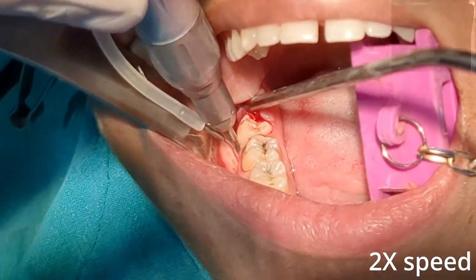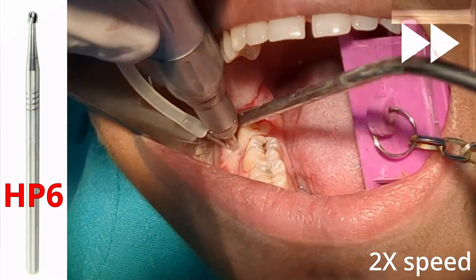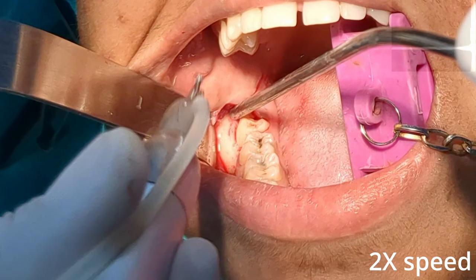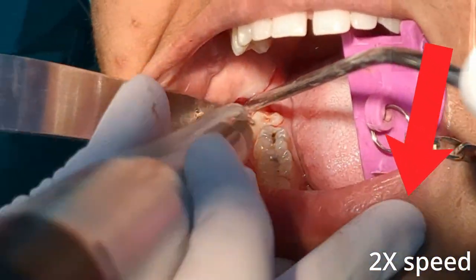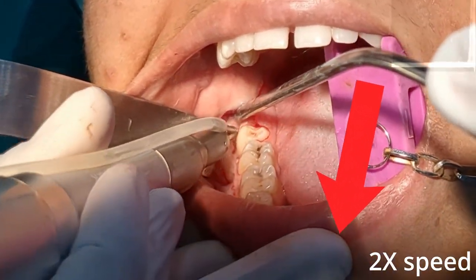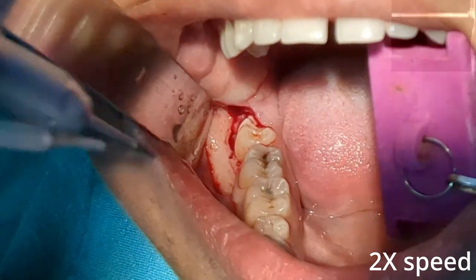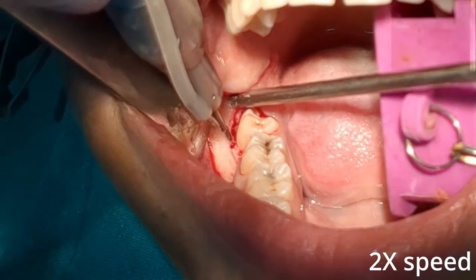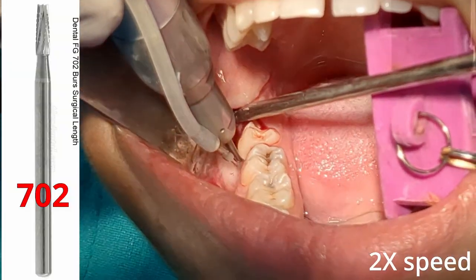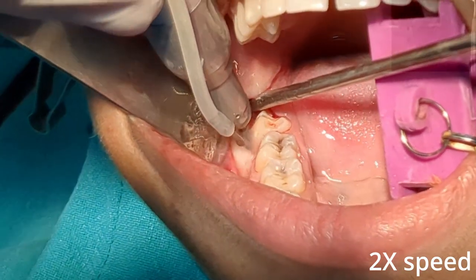I then create ditches in the bone surrounding the tooth using an HP-6 round bur. For precise bone cutting, make sure that you stabilize your hand by taking support from the surrounding hard tissue. Then, using a straight 702 bur, I connect those ditches to create a bone gutter around the tooth.